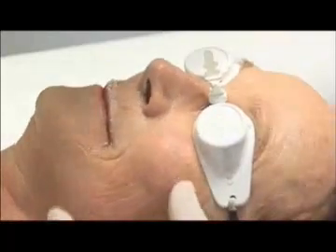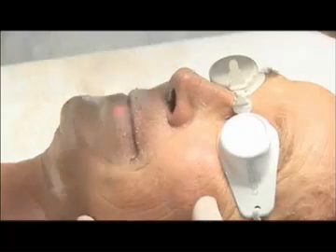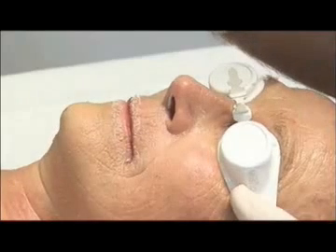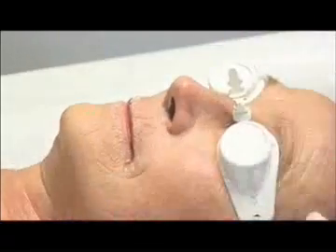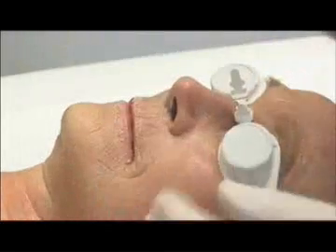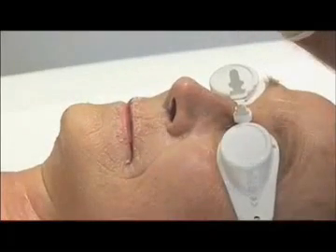Ça va? We have treated the upper and lower lip, and we will continue. I'm now increasing the size of the impacts. This was a square impact of small size to give precision around the contours of the lips, and now we are widening the area.